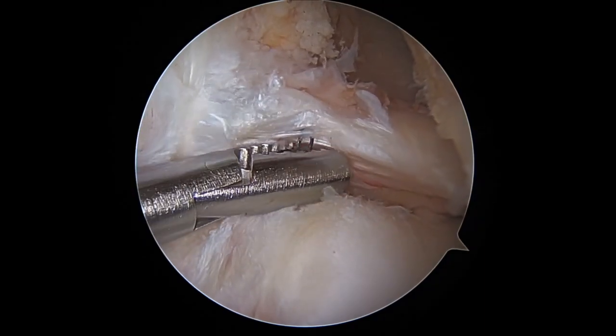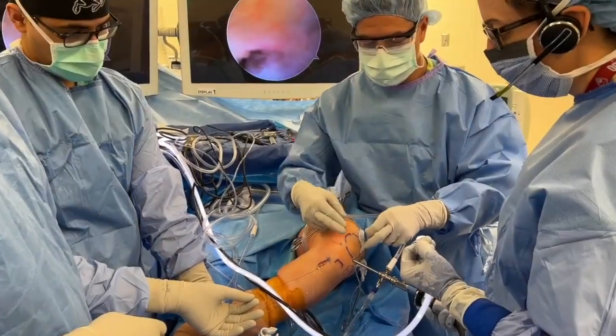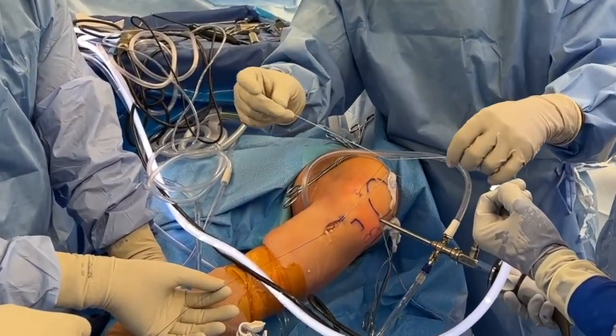The aiming guide is removed and the drill pin is advanced through the tibial plateau cortex. The looped end of a lasso wire is passed into the joint and retrieved through the inferior medial portal, where it is exchanged for a fiber-linked suture.